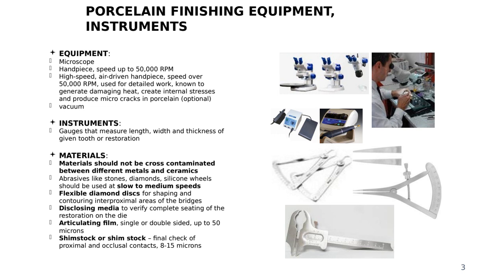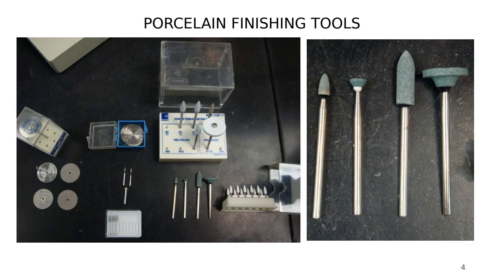So do we use the burr to redefine the anatomy, the grooves? Yeah. When we define the anatomy, you use specific shapes of burrs.